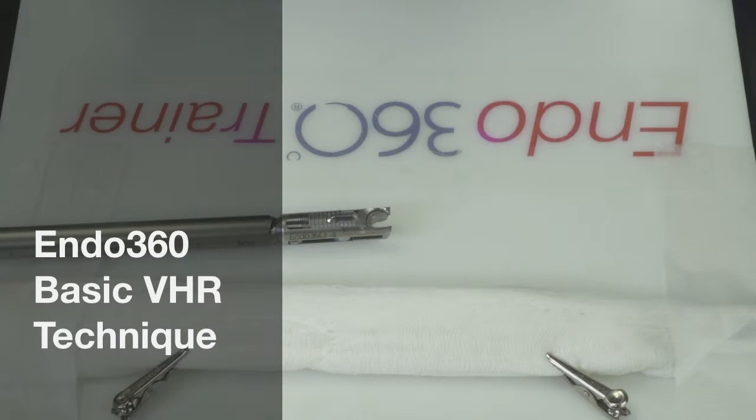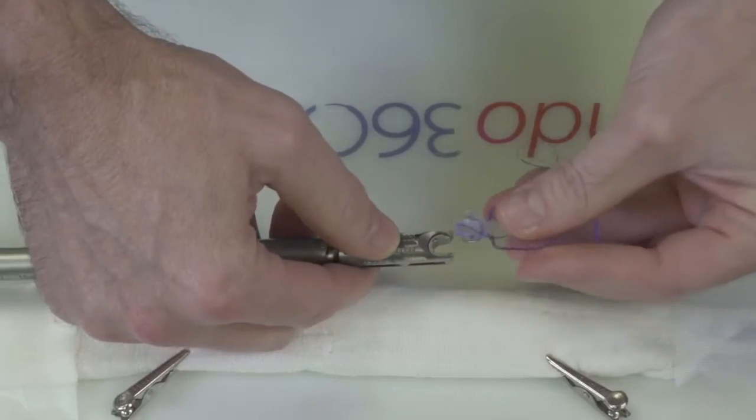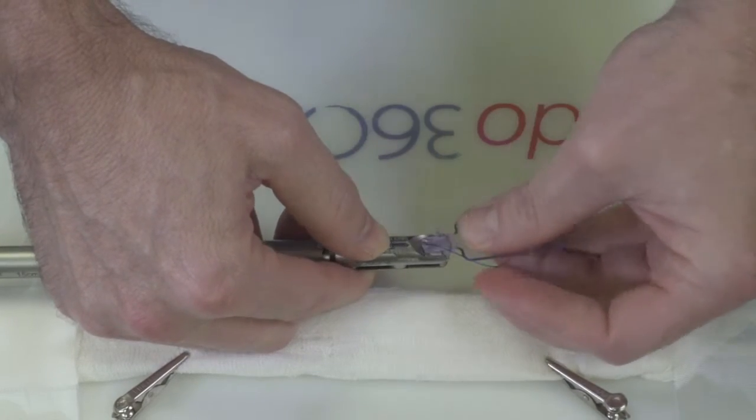So the first thing we're going to do is just load the needle. And this is what we like our nurses to be doing on the back table. So I just have them set it up as I normally would.